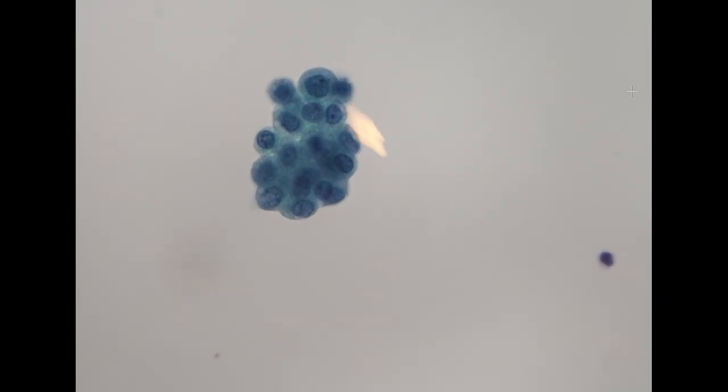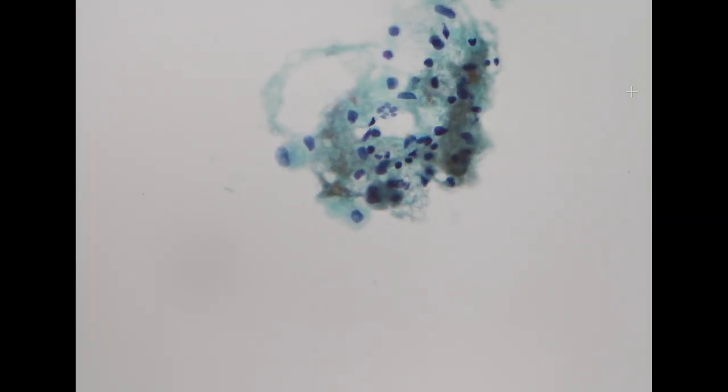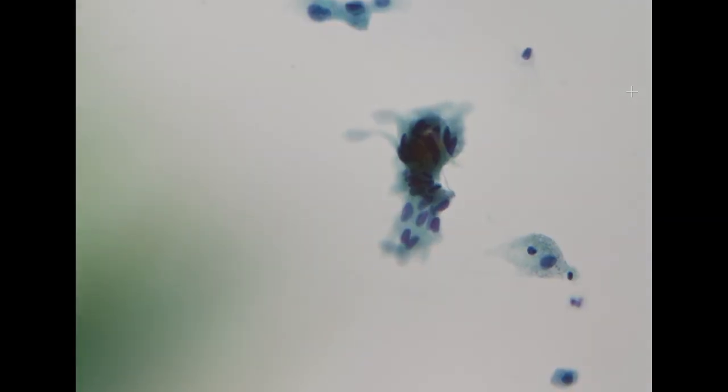So in the CSF specimen, sometimes it's, I would say, paradoxical that metastatic adenocarcinoma can actually have a very, very bland morphology. But because the normal condition is no cells, you really have to check whether these are actually metastatic adenocarcinoma.